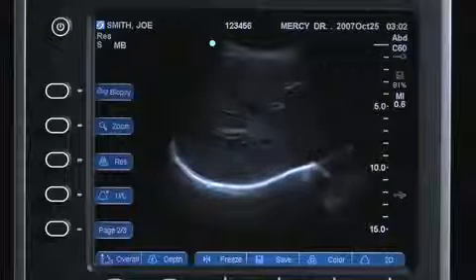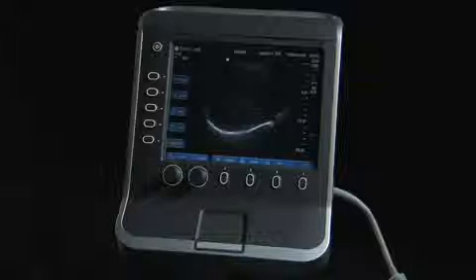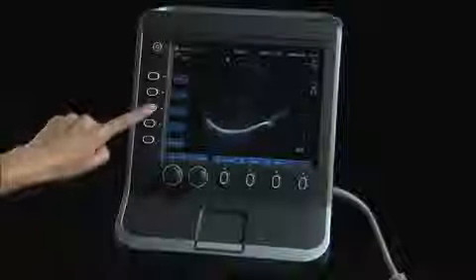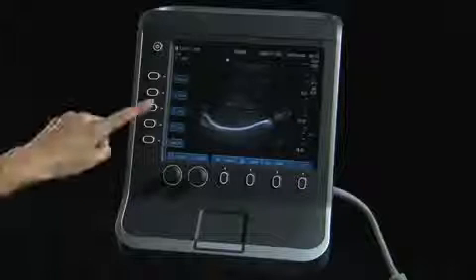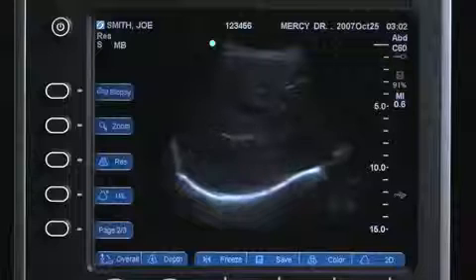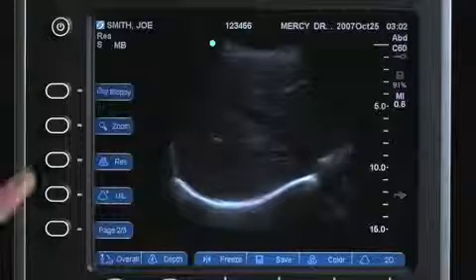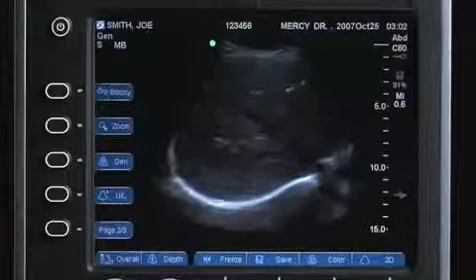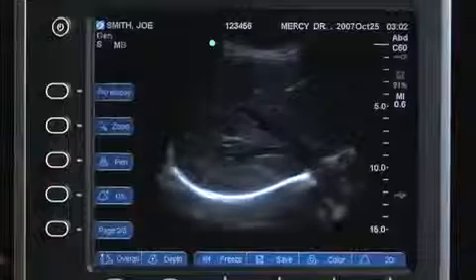To optimize the image, select 2D optimization settings based on the patient's body habitus. The system will automatically adjust features such as focal zones, transducer frequency, and bandwidth. Res provides the best resolution possible. Gen provides a balance between resolution and penetration. Pen provides the best possible penetration.